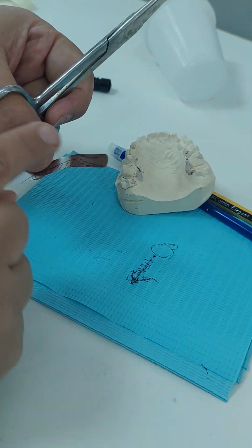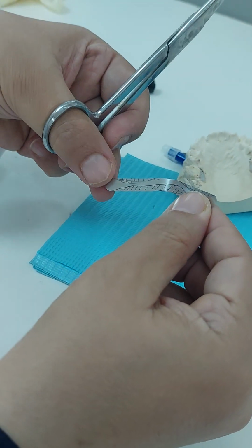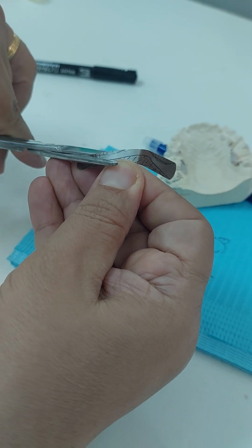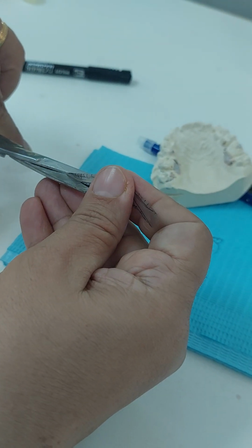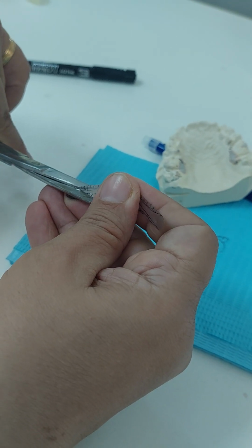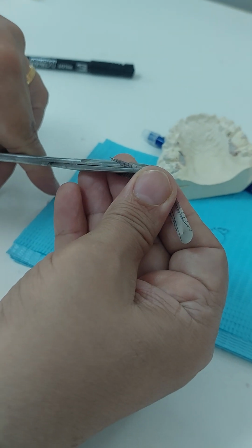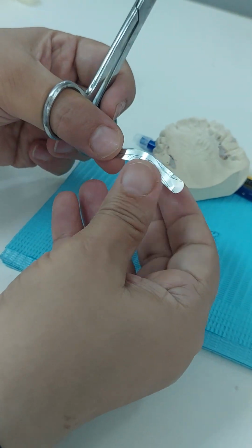So see the V shape, this is the deep area, okay? I'm going to cut laterally. From the deep area, I'm going to cut laterally, leaving a thick area at the edges for the Tofflemire to hold, because you're going to pin it with the Tofflemire. See? So what did I avoid?